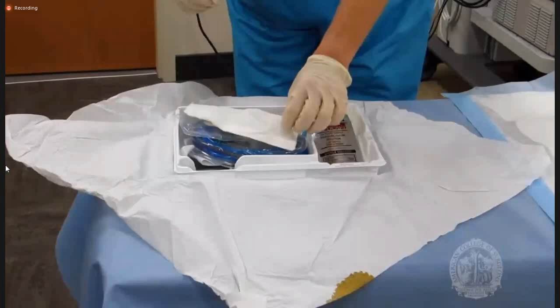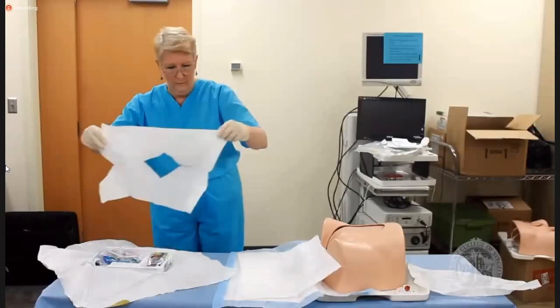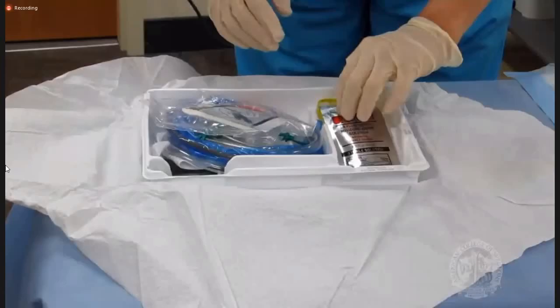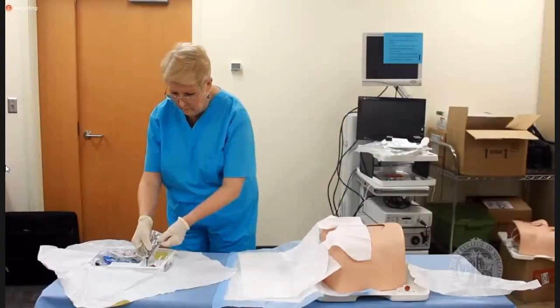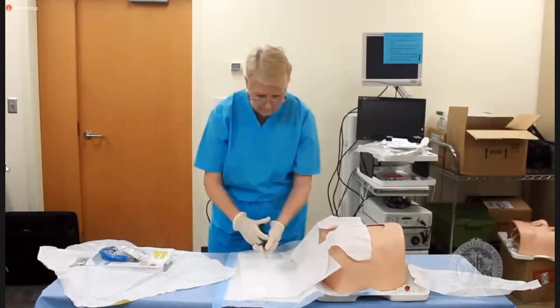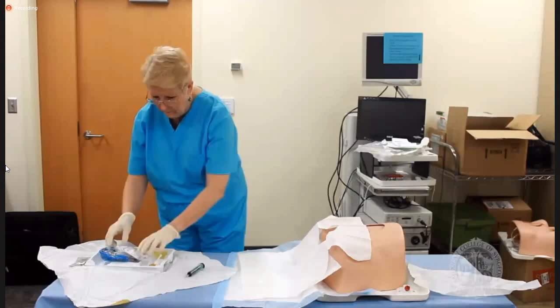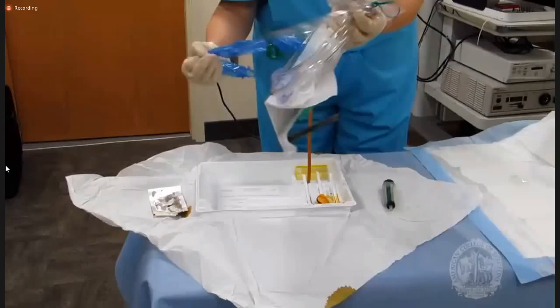Open the fenestrated drape and place it over the patient. Pour the iodine over the applicators and squirt the lubricant onto the sterile surface in front of the patient. 2% lidocaine jelly can also be injected directly into the lumen of the urethra with the syringe. Remove any packaging and connect the collection tubing to the catheter.